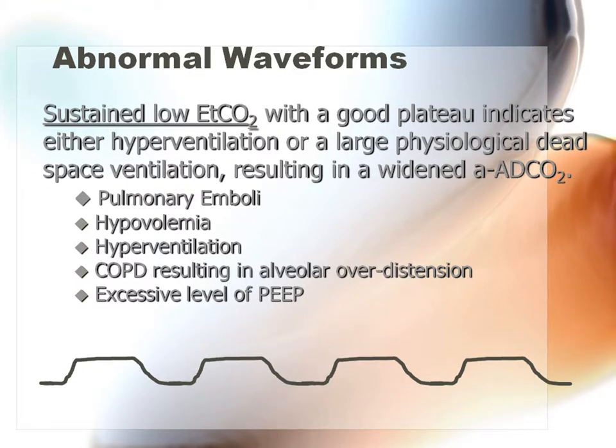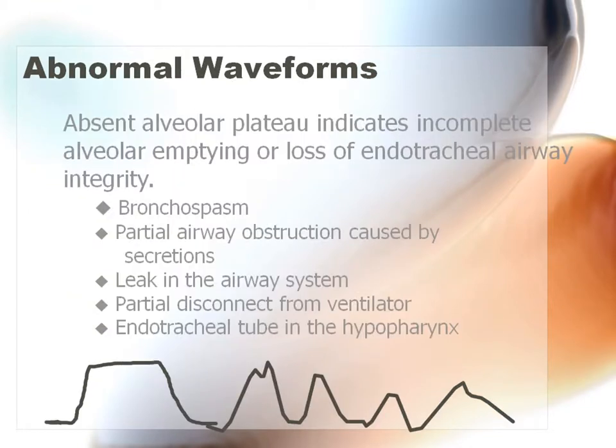One of the big things I always want to point out is the bronchospasm ones. If it's low, why are you not offloading? That's like the COPD with the pursed lips, this tenuous blowing. So this screams equipment problem right there. I wouldn't be concerned about bronchospasm if you're seeing all this erratic behavior.